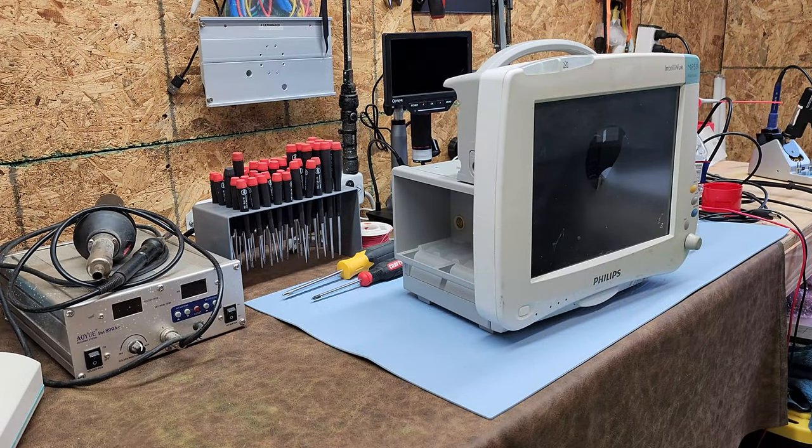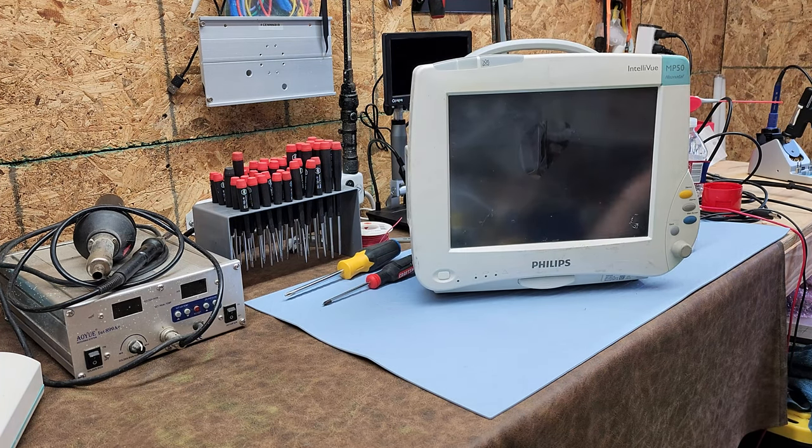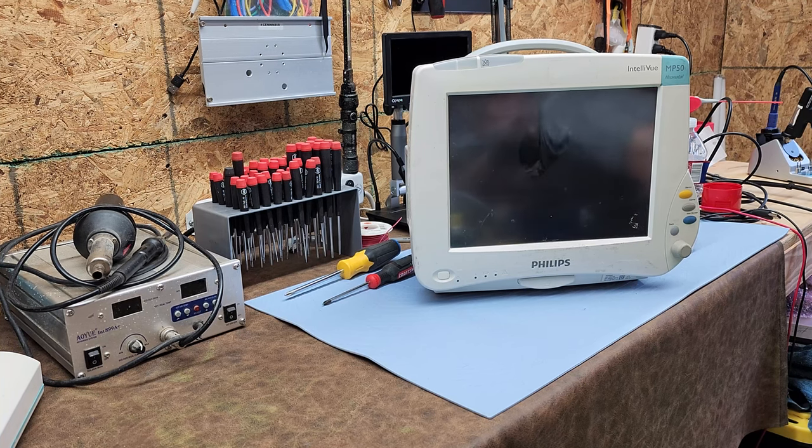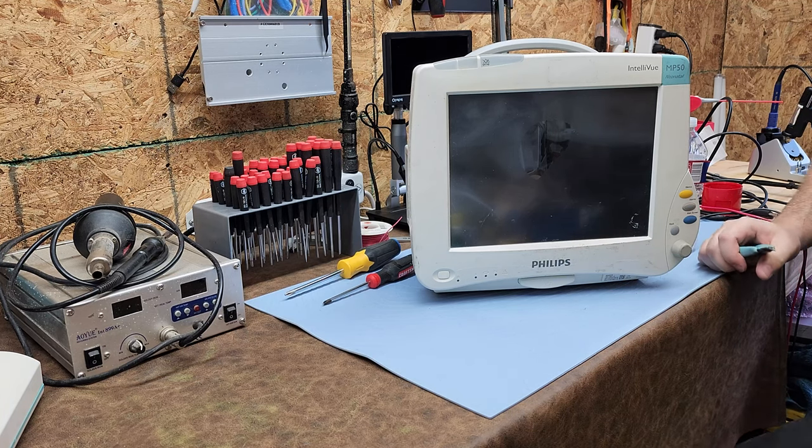Welcome back to Better Biomed. Today I have the Philips Intelliview MP50 — a very special device for me because I've worked on Philips for years. It has been a stepping stone to get me where I am today.